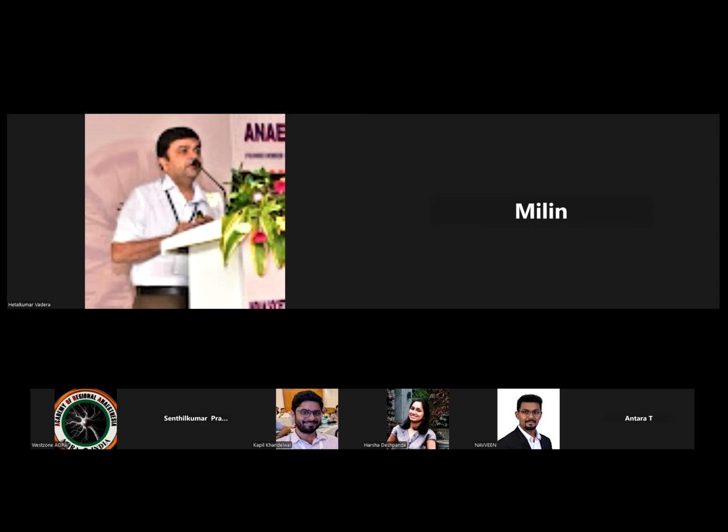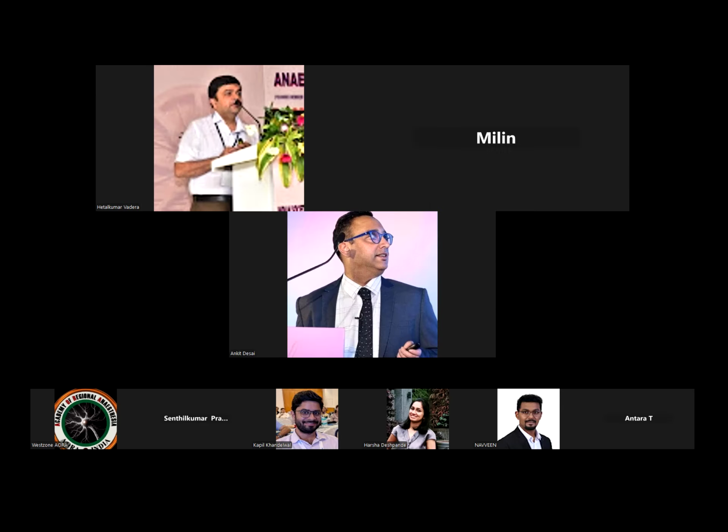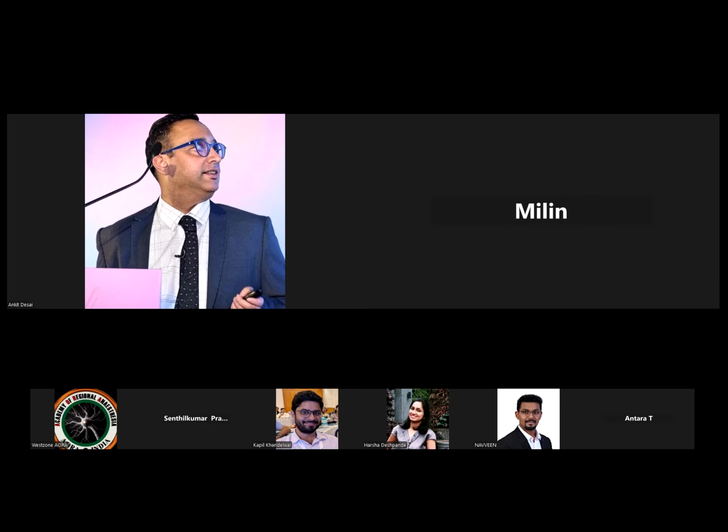Yeah, absolutely. Milind, you're absolutely right. Actually, this is one of the blocks where it has been proven that dual guidance is better than ultrasound alone. So you have to use dual guidance. It's always preferable to use dual guidance because of the same reason. It's a deep block, and secondly, there are lots of intramuscular tendons within the psoas muscle which can be confused with the nerve. So to be absolutely sure, it is always better to use dual guidance.